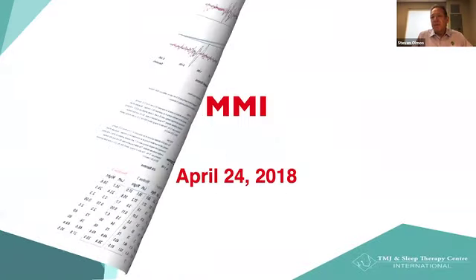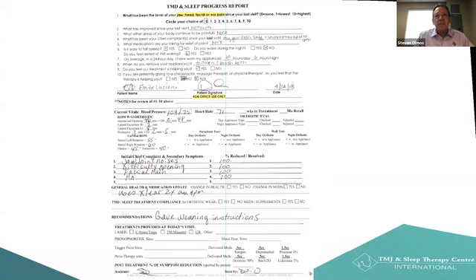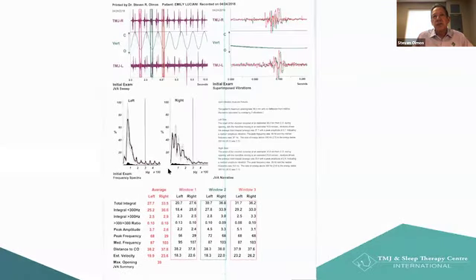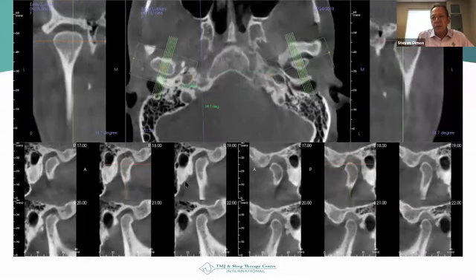So this was a case I show because it was really difficult, because sometimes patients don't remember things or they can't quantify. And it's good to quantify what's going on, because I didn't want to get in an argument with the woman, saying, well, of course they're better, but there's no objective proof. So at maximum medical improvement, which is 10 to 12 weeks in our practice, I took a new JVA at this point, and you can see that joint noises are now 100% resolved, as are all the other symptoms. So now we began the weaning process, and now we have stability of the jaw joints, and we can prove that. And so this is the position that she had with the decompression appliance.